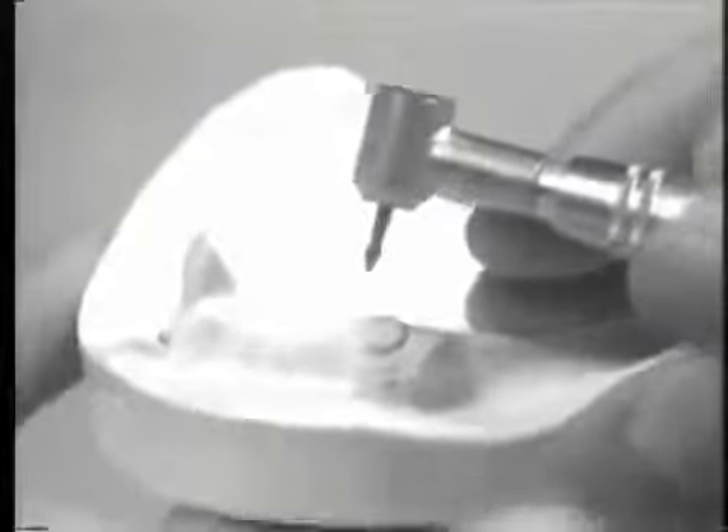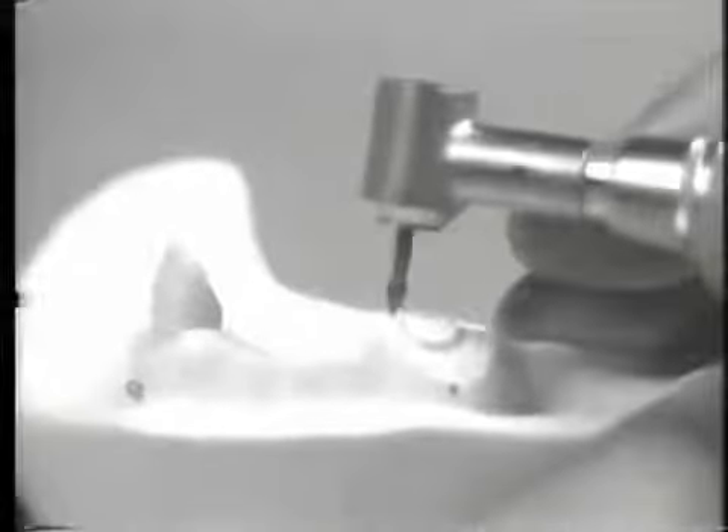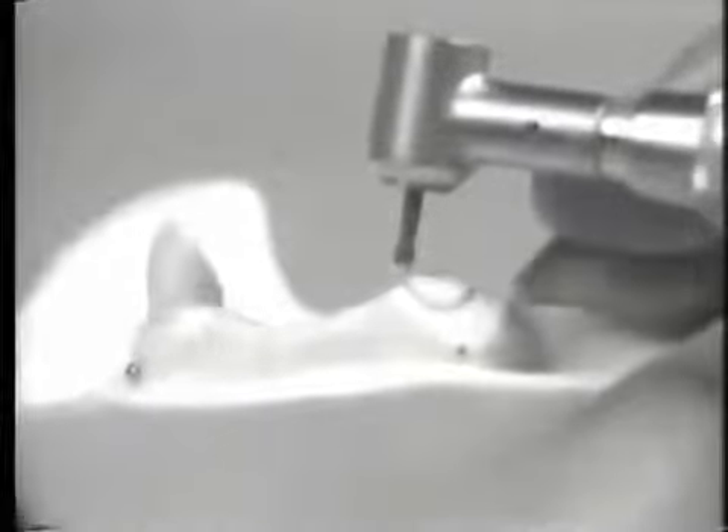Gross reduction of the overdenture abutment has now been completed. A brass shank tapered finishing burr is now used for placement of a circumferential bevel. The bevel should be of adequate width at a moderate angle to allow for gold coping design and finish consistent with current principles in operative dentistry. In the presence of existing restorations which encroach upon the cervical portion of the tooth, it is acceptable to utilize a beveled shoulder, a chamfer, or a long tapered bevel margin.